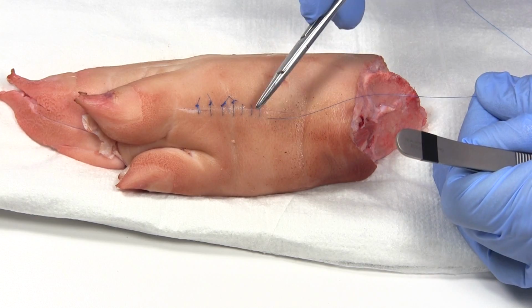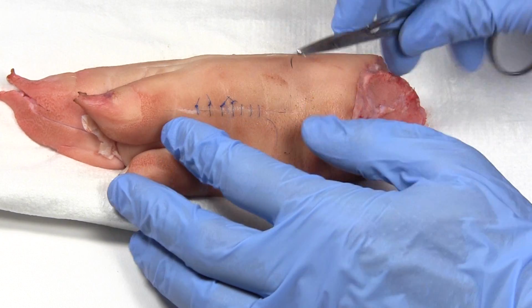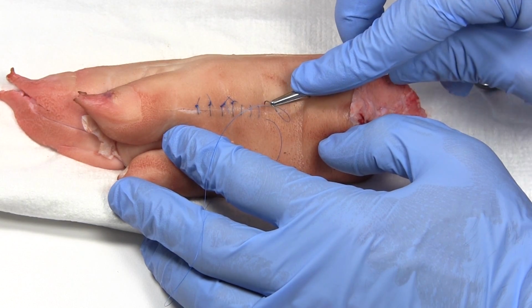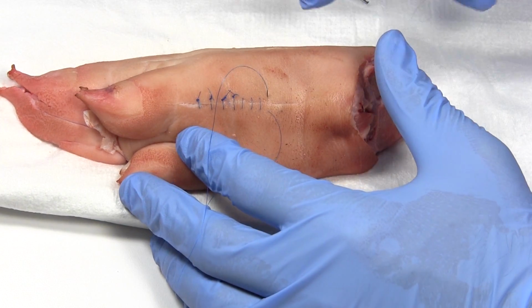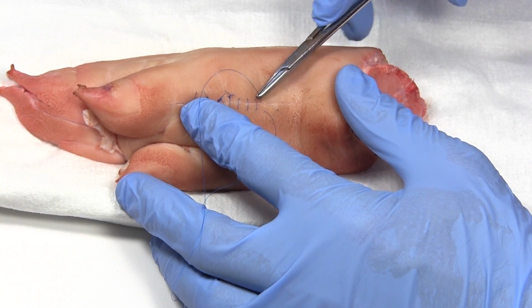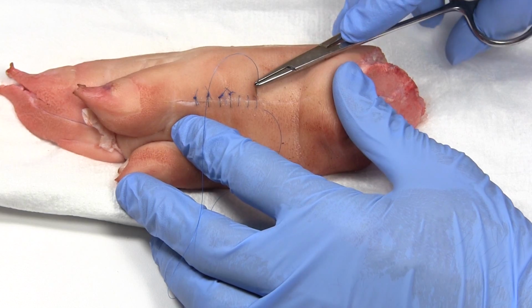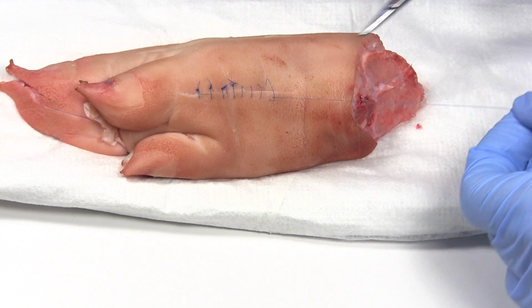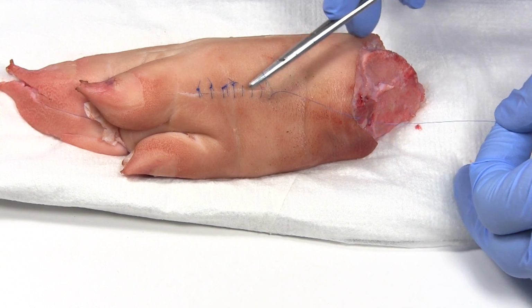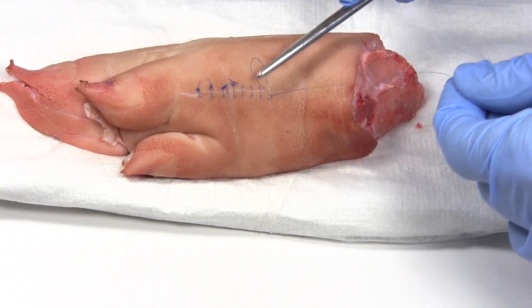Now when you get to the end, you need to put a knot in the other end. Also very simple to do. I'll show you how to do that. So you put in the last suture, again straight across. Now instead of bringing this one out way over here, what you're going to do is bring it out just to the side of that last stitch. You would bring it through just to the side of that last stitch and you leave a little bit of a tail here, a little bit of a loop. And that's what you're going to use to tie that knot.